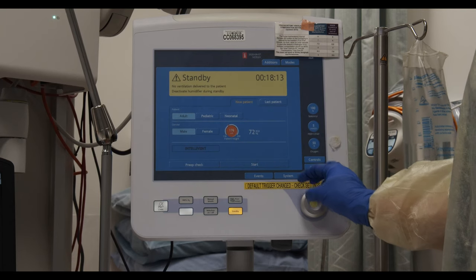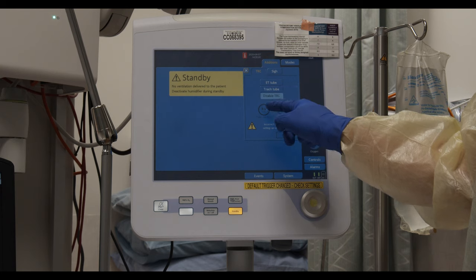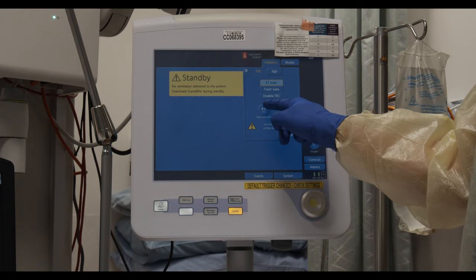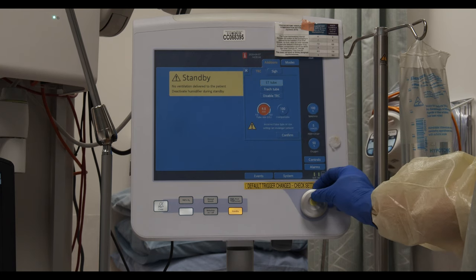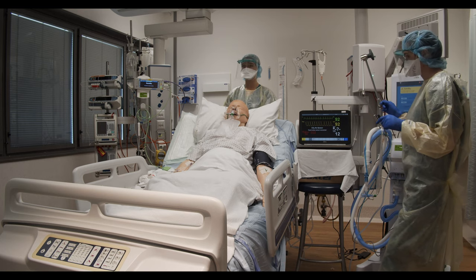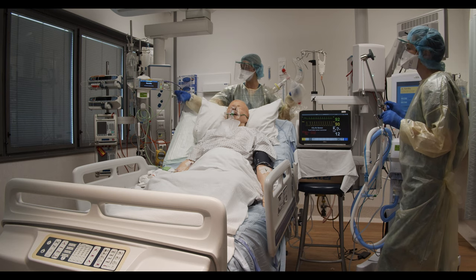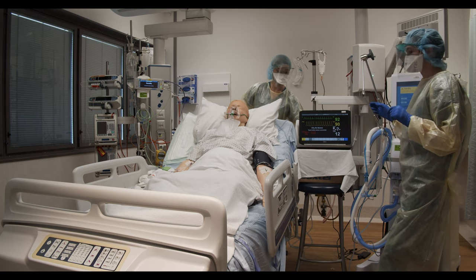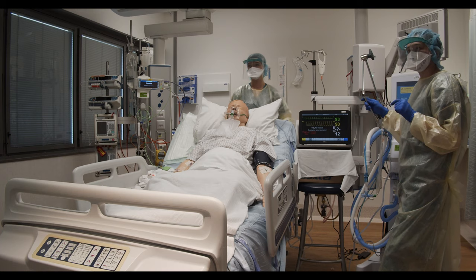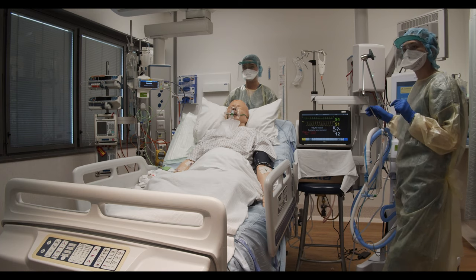And preparation for a surgical airway, which will include a scalpel, bougie, and a size 6 ET tube. Next, we should ensure that the ventilator is set up and ready for our patient. This will include adjusting the patient-particular settings and the ventilator settings. With regards to patient monitoring, we should ensure that a SATS probe is attached to the patient, the end-tidal CO2 cable is connected to the ambu bag, there's ECG monitoring attached, and the blood pressure, which is likely to be non-invasive at this stage, is cycling every 1 minute.